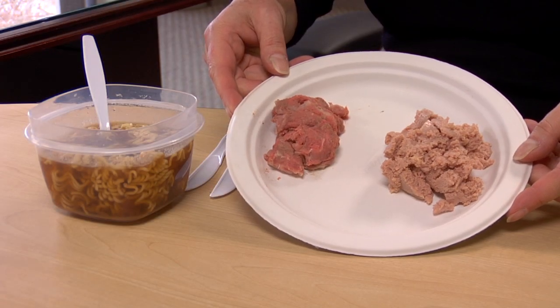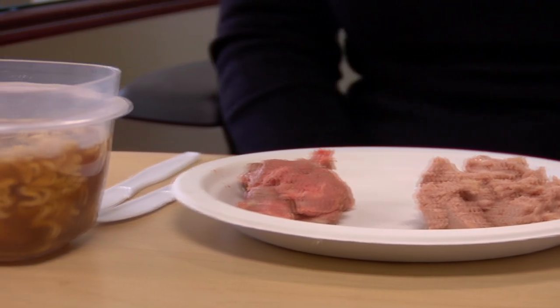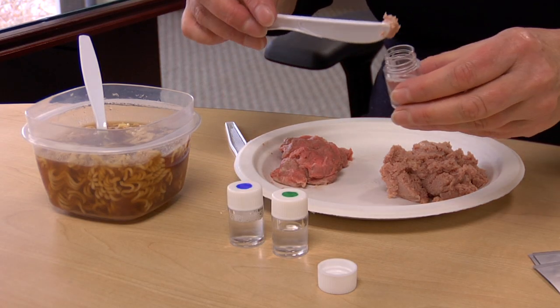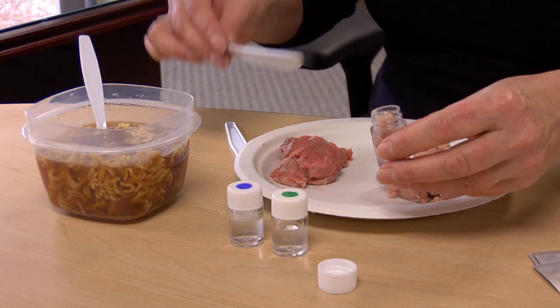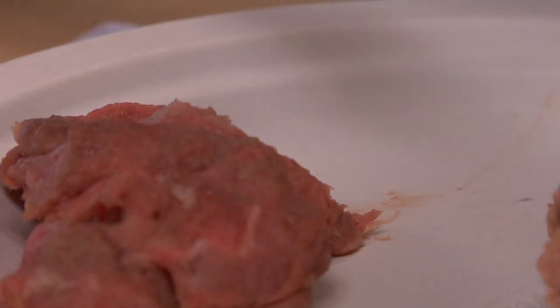Here you see a variety of samples that include raw meat, processed meat, and soup. We would like to know if each of these contains pork. We cut up about 1 gram portions of each and place into the pre-filled vial with about 3 milliliters of extraction solution. We shake the vial for 30 to 60 seconds to be sure as much pork protein as possible is extracted.